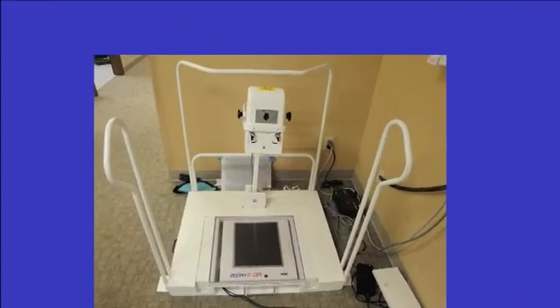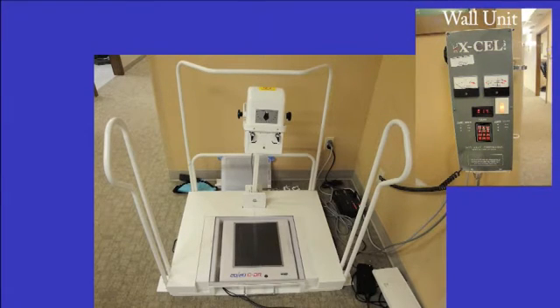The X-ray machine consists of a wall unit, much like the unit in Centralia, although this unit is to be turned on only. The calibration of pulses is not necessary because it has been taken care of through the digital computerized system and has already been done. The only thing you'll need to worry about on the wall unit is the power switch, unless directed otherwise by the physician or your trainer.